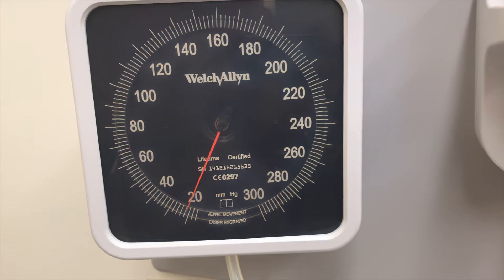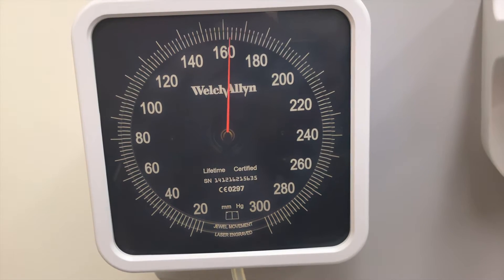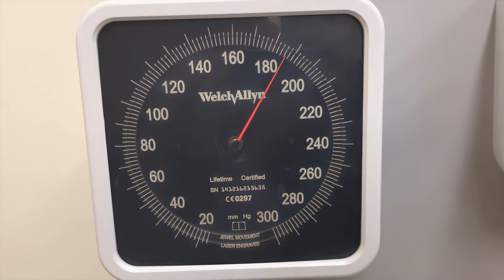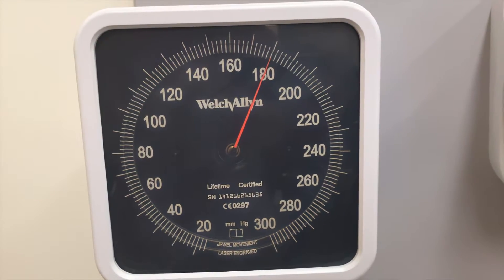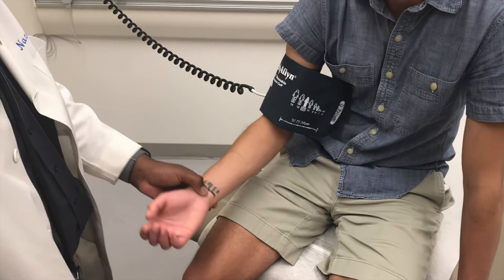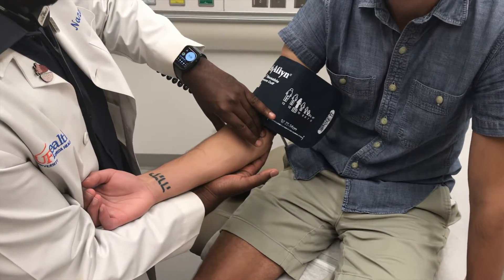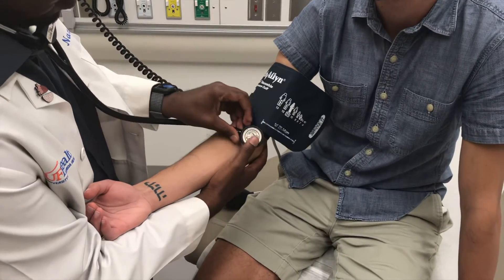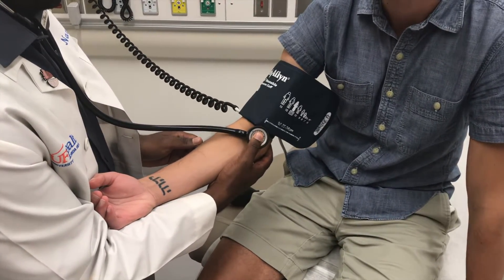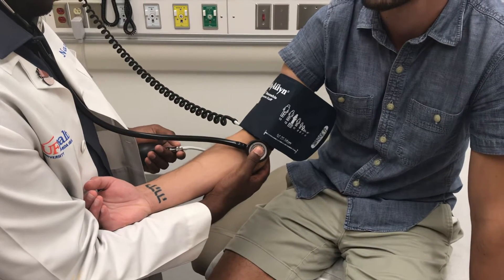This is a blood pressure gauge — we typically pump up to 180. This is how it looks doing everything at once: we support the arm, check the brachial pulse, put the bell of the stethoscope over the brachial pulse, then pick up the pump and prepare to inflate the cuff. It may be helpful to pause. This concludes part one.